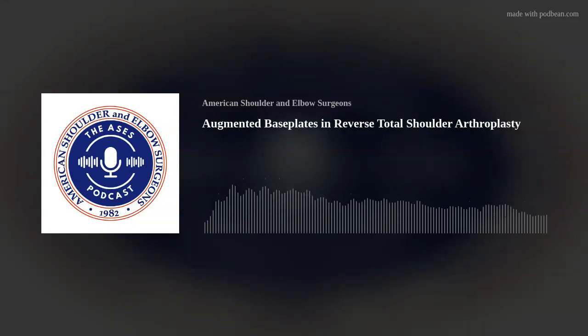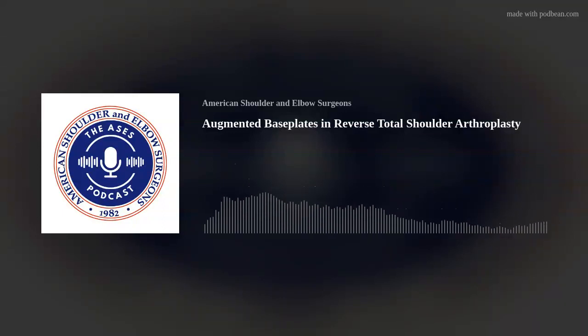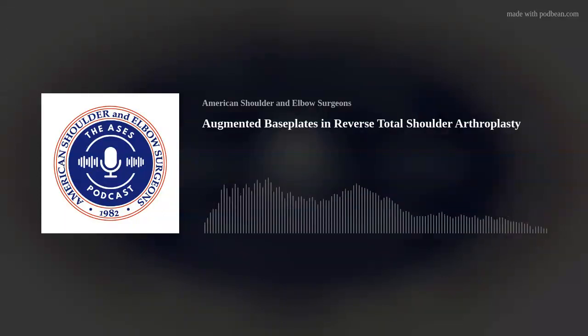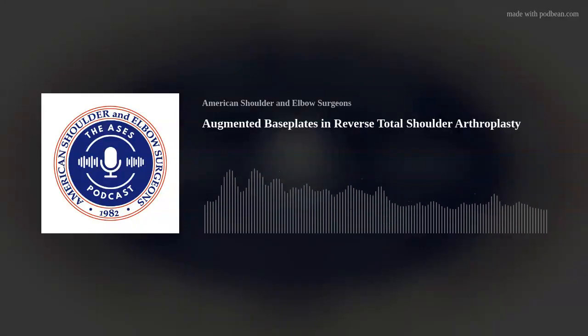Okay, so let's start at the beginning. And I want to start with a clinical scenario. So you're facing an elderly patient with a massive irreparable rotator cuff tear and pseudoparalysis. So I think hopefully all of us agree this is a reasonable patient for a reverse total shoulder arthroplasty. And let's say there's no glenoid deformity. It's a normal glenoid. And the reason you're doing the reverse is not for arthritis, not for glenoid deformity. It's solely for an irreparable cuff tear. And the question I want to ask each of you is, for this patient with no glenoid deformity, are you routinely using a bone graft or an augment, or is this a patient that gets a standard base plate? So Andy, how would you approach this patient?